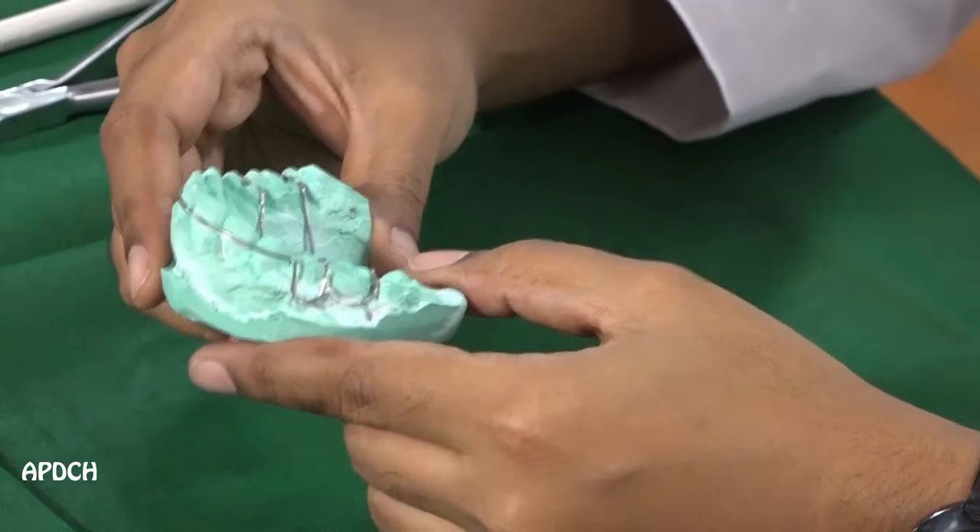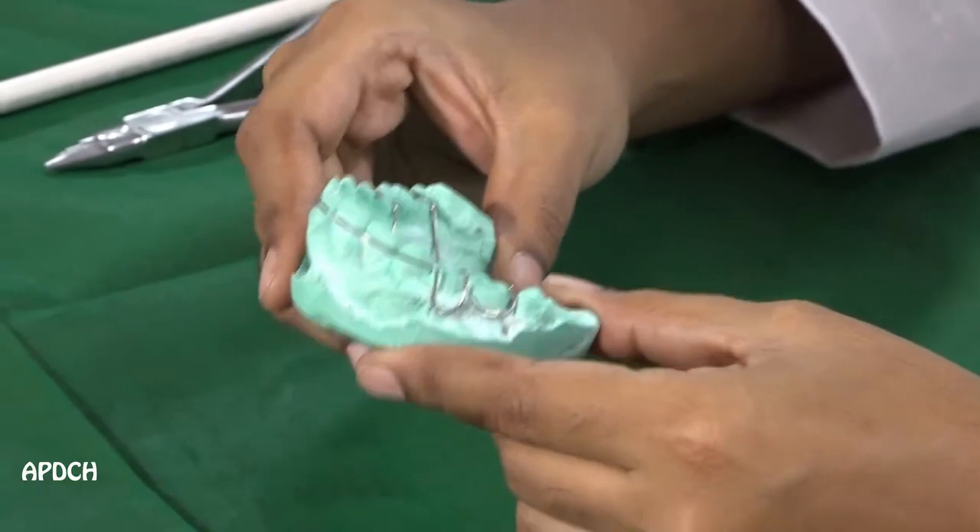Now we are going to see about Hawley's appliance. It is a type of removable appliance, and after the completion of the fixed orthodontic treatment, in order to maintain the tooth position exactly where it is, we use this type of appliance.